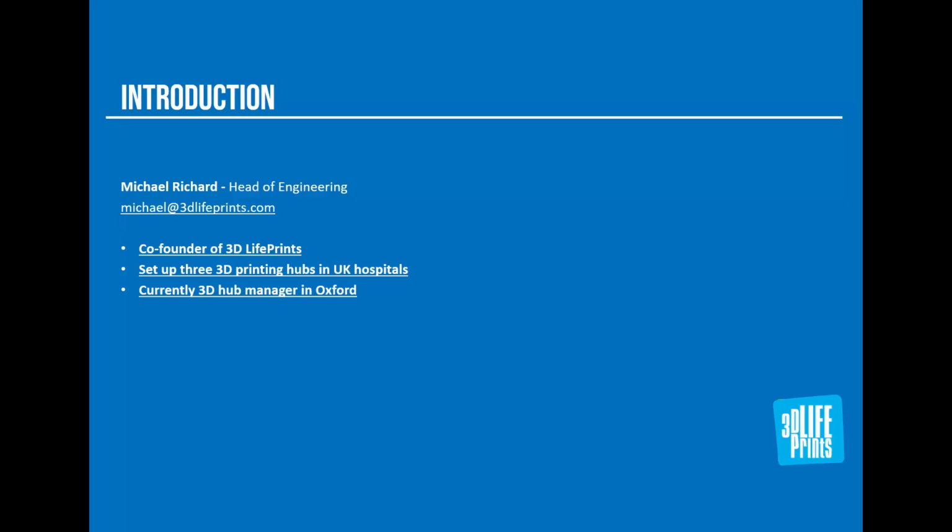A 3D printing hub is normally several 3D printers, several workstations, some software suites such as Simpleware, and a trained biomedical engineer who has knowledge of both anatomy and engineering and is able to provide services and skills to produce a variety of medical devices and anatomical models.